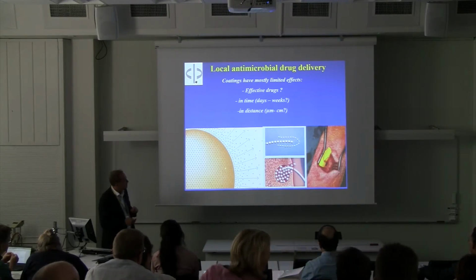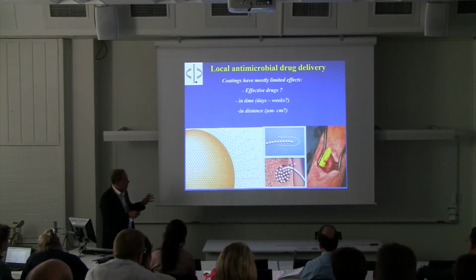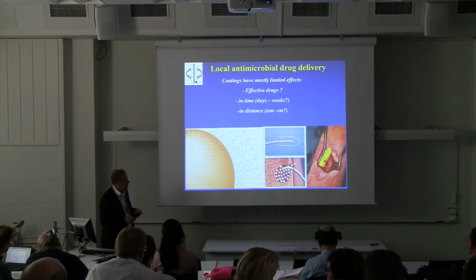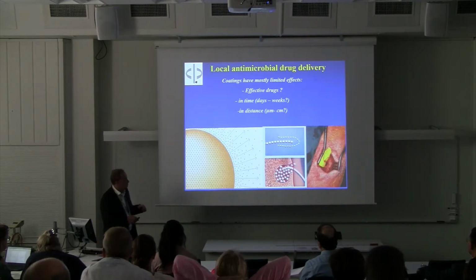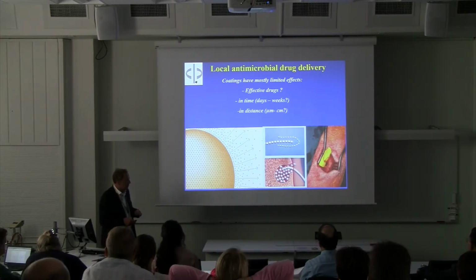And the physical principle is that gentamicin is completely embedded into the polymer, and after implantation the drug will be released in a sustained manner, creating very high surface concentrations, very high local concentrations, killing in the neighborhood of the device all bacteria, which is not possible by any systemic application. These concentrations are about 100 to 1,000-fold higher compared to any systemic application. That's the reason why in surgery such devices are being used.